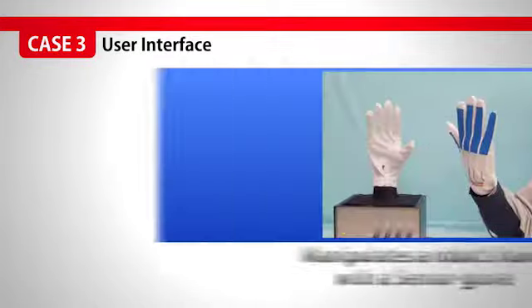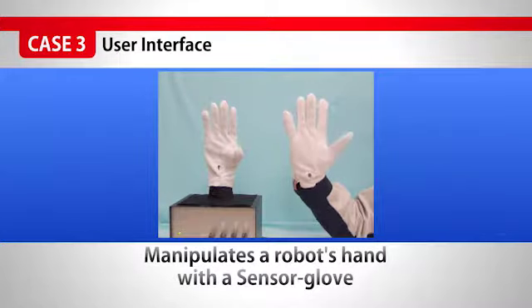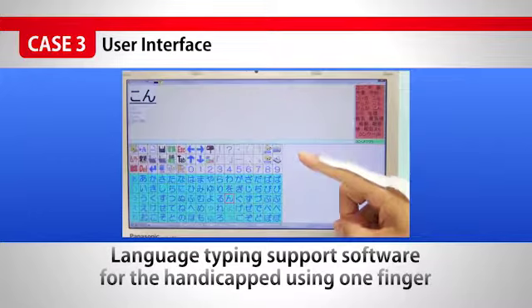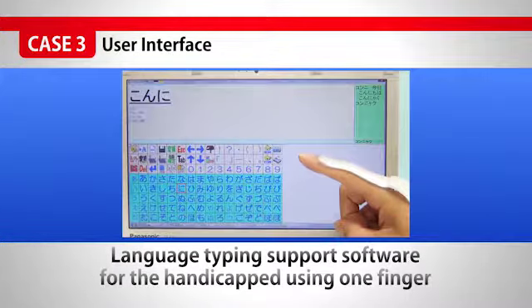For usage as an interface for other devices, we can manipulate a robot hand from a C-Stretch attached glove. We can also operate language typing support software for a handicapped person using one finger.